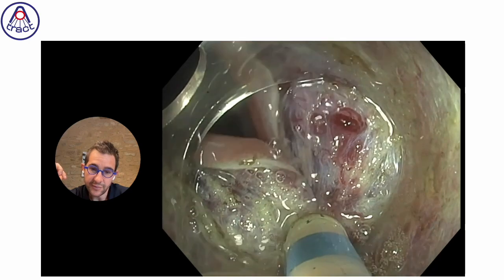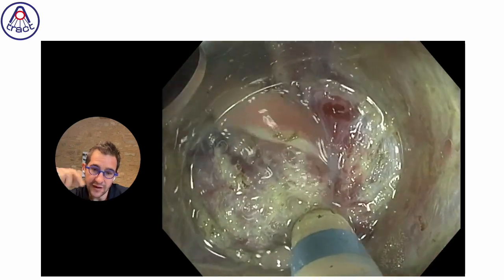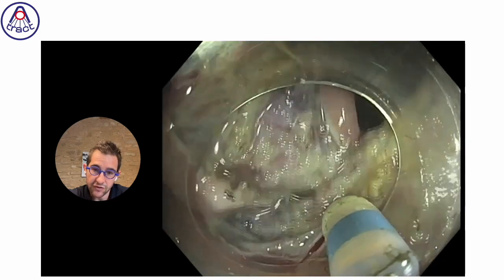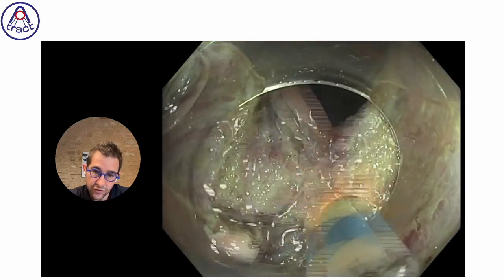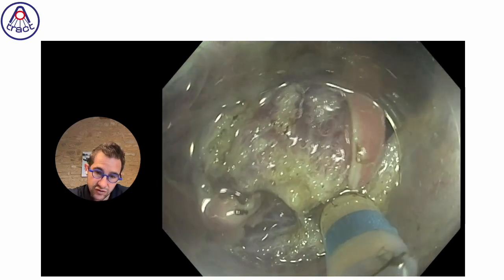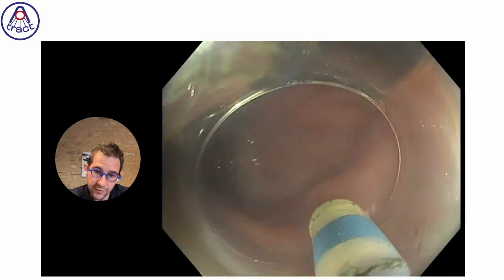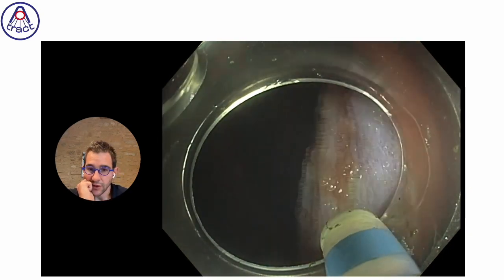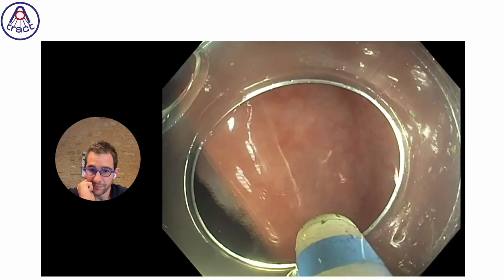So here, despite my effort, you can see that my knife is fixed on the clip in the last clip. So I should work a little to go deeper in order to avoid damage on the specimen by cutting the last fibers. Here, the procedure is achieved. So the chronometer says 19 minutes.